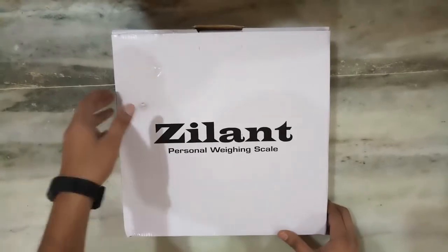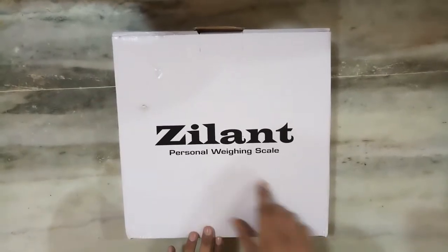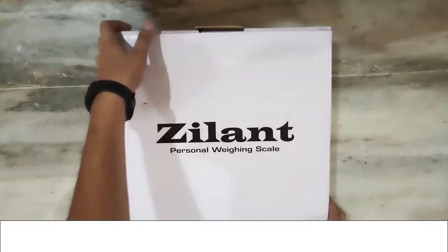Hello guys, welcome to the channel. Today we are going to review Zilant personal weight scale. Let's unbox this.